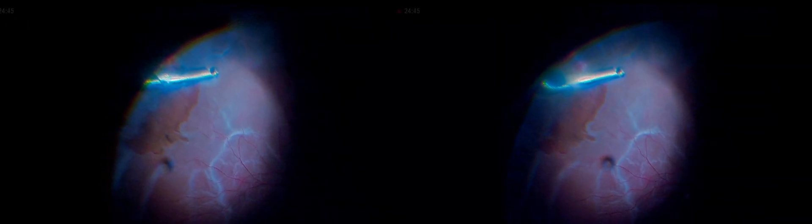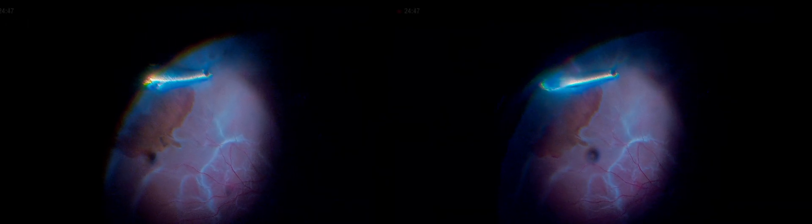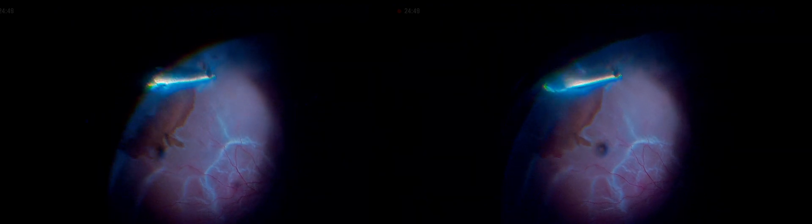Now we are relieving the superior part. You don't really need to pursue the retina — the retina comes towards the cutter. And now inferiorly, so that you relieve the retina thoroughly.